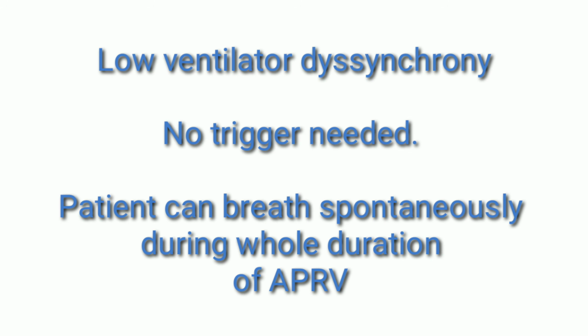So because it's a CPAP mode, there's low ventilator dyssynchrony, there's no trigger, and the patient's breathing like it's a true CPAP, which is really good because that helps maintain your diaphragm strength and your diaphragm function. We want variations, modes that create more variation in support, which helps with the maintenance of lung function.